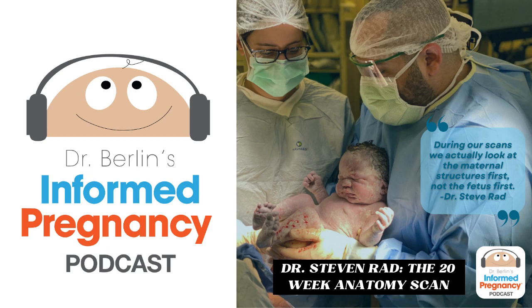Anyway, the first thing you look at is actually the maternal structures first, not the fetus first. So I always make sure there's a heartbeat on the fetus, and then we continue. Then I look at the mom's cervix, and I want to make sure the cervix looks long and closed. Then we look abdominally. We do a vaginal ultrasound at the end.